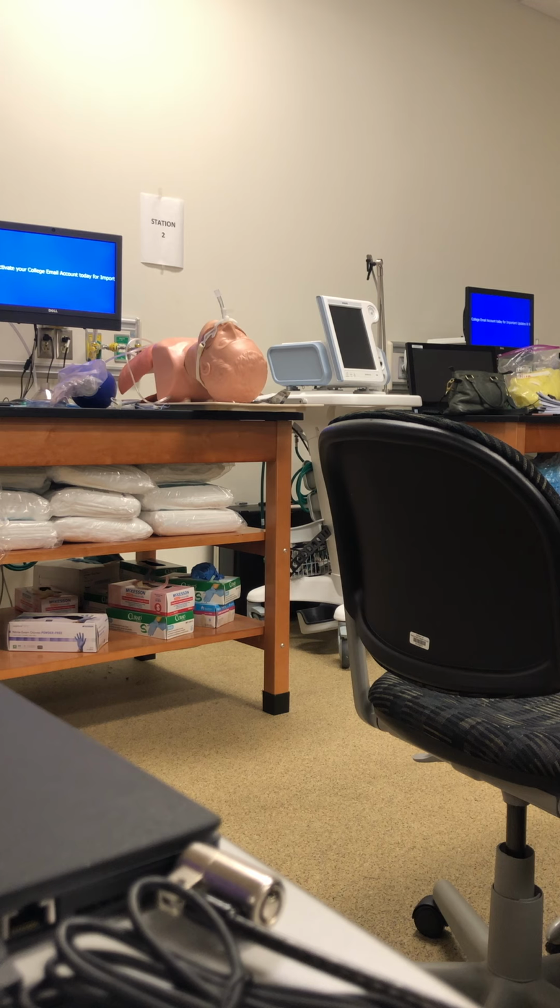See how it takes practice? Okay, so push it in further. Like push it in here like this. So, take it, push. You gotta push before it clicks. So you're gonna push. Push, yeah, forward first. Push that way. There you go, you just clicked it. Your light's on? Okay, so take it off and then put it back on.